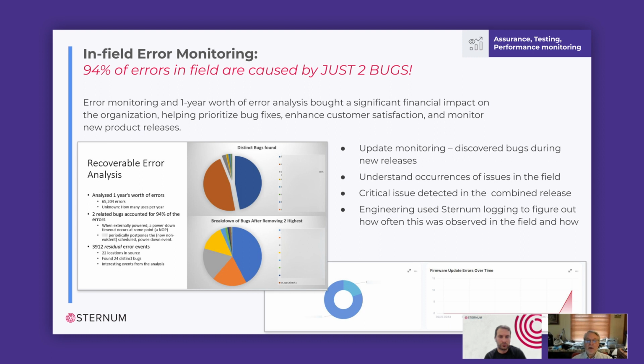And we log that as an error, even though it's normal operation in most cases, because we wanted to catch the cases where we went to cancel it and it wasn't there. But it turns out that we were over-reporting that particular use case in the error logging. Once you boil away the overhead like that, we drilled down into what the remaining error reports were, and then used that to look at the source code and see if these were actual bugs and how to resolve them.